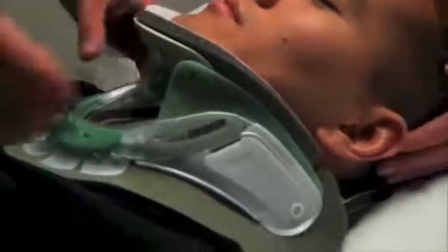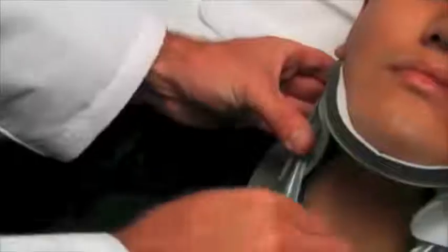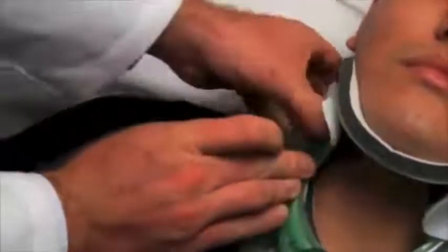While holding the front panel in place, attach the loop strap from the back panel on both sides. Anchor your fingers on the front panel and peel back and tighten the loop straps. Keep the back panel centered by tightening each side equally.